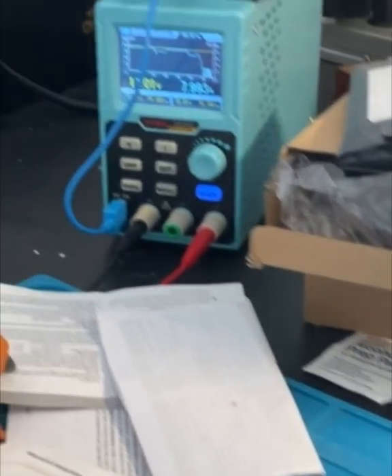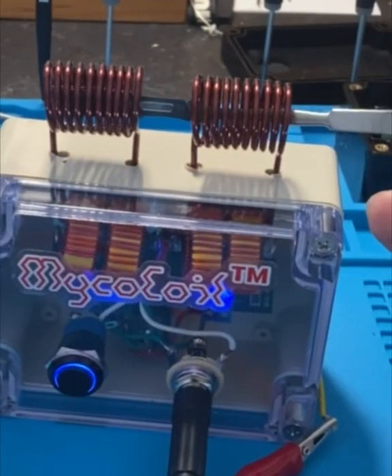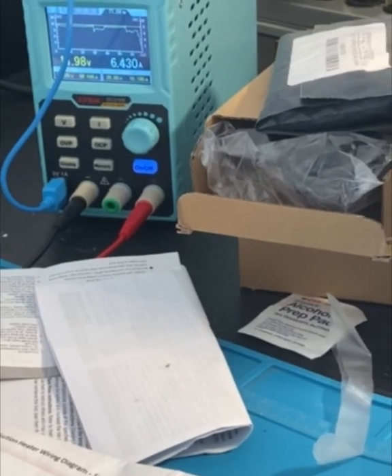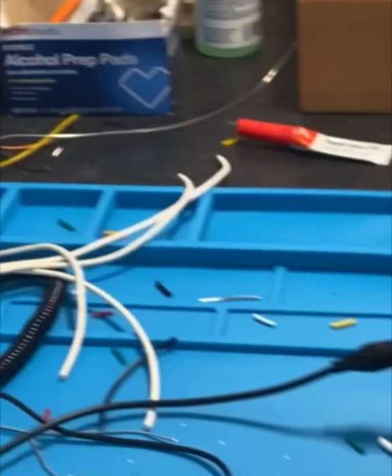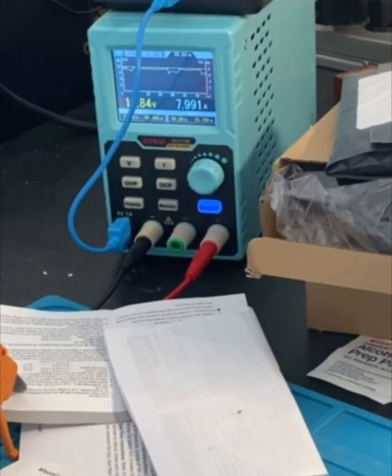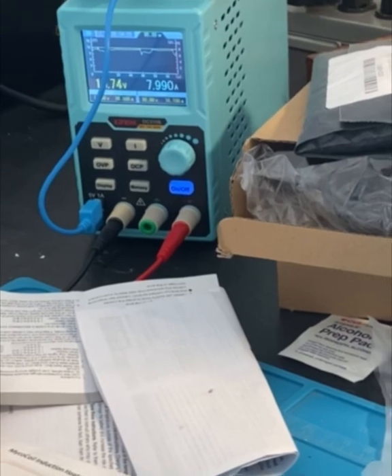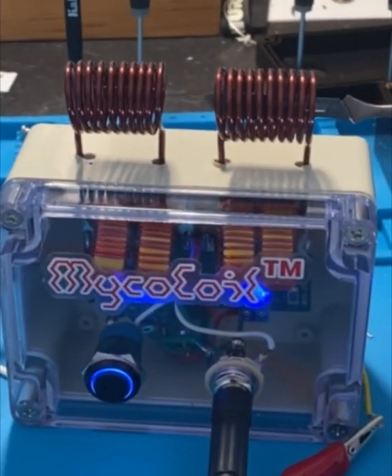I'm pulling 8 amps at a little over 11 volts. It goes up and down depending on how I move. When I go to just one coil it drops down to 6.8 amps. Putting it in both coils we get 7.9, almost 8 amps. That's great — I'm not overpowering anything, and I've held it down for a good minute now.